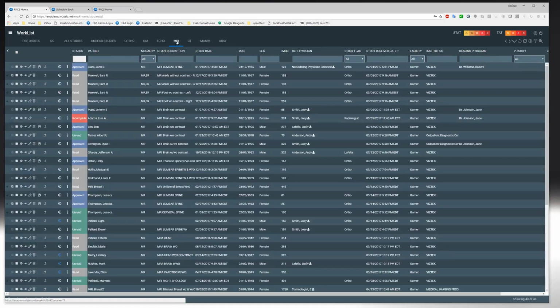So in other words, if I have several different facilities that I'm looking at, and I have a workflow where I want to get data from all of those sites, and yet I want to be able to separate out those sites so that perhaps you don't want some reading groups to see other reading groups' patients.